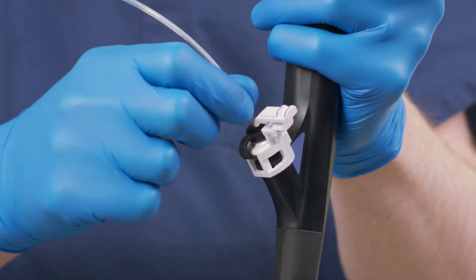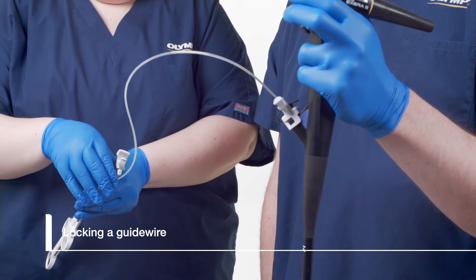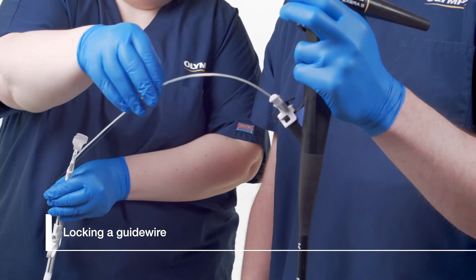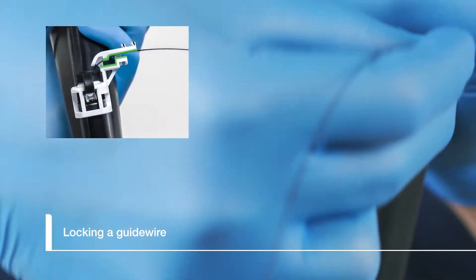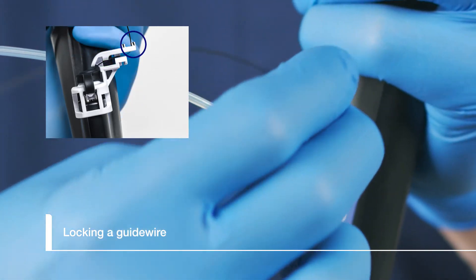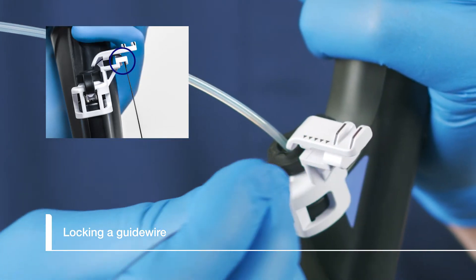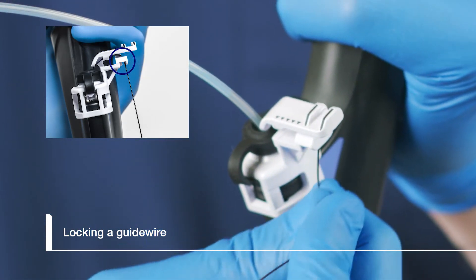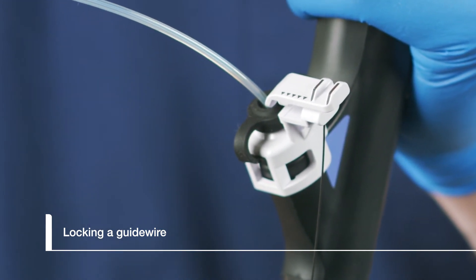Lower the elevator if needed and continue advancing the sphincteratome. Strip the guide wire down to the biopsy cap. Lead the guide wire in a counterclockwise direction through the locking arm channel and into the locking slot. Arrows on the locking arm indicate where the guide wire needs to go. Ensure the guide wire stays in the locking arm channel and secure it into one of three slots. An audible click sound is made when the guide wire is secure.